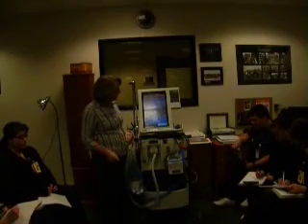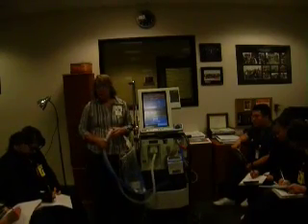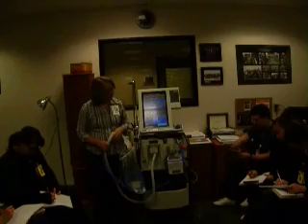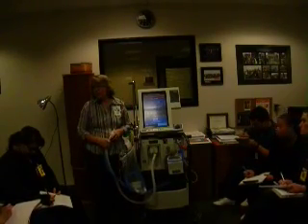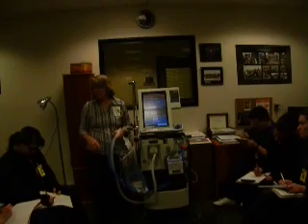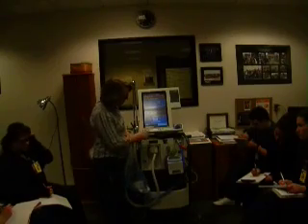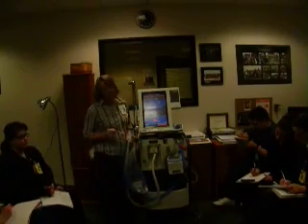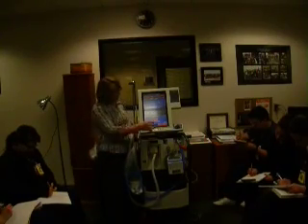But to put it on a new patient, we're going to hit new patient, because that's what we want to do. And then you'll see it has a box for ideal body weight. We don't use that, no one does, but you can put in the ideal body weight, and then the ventilator will set settings that it thinks is appropriate for that size ideal body weight. So I just typically bypass it, but you do have to touch it to get to the next spot. You have to at least touch ideal body weight, and then hit continue.